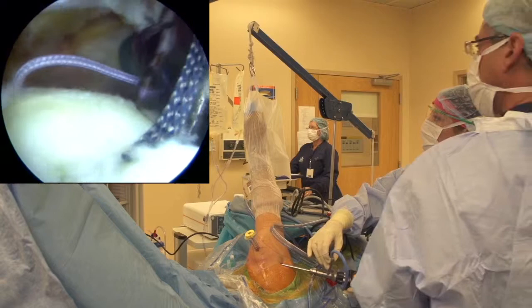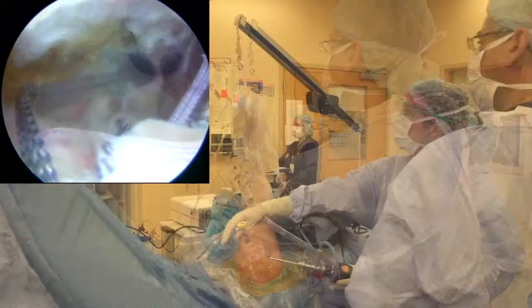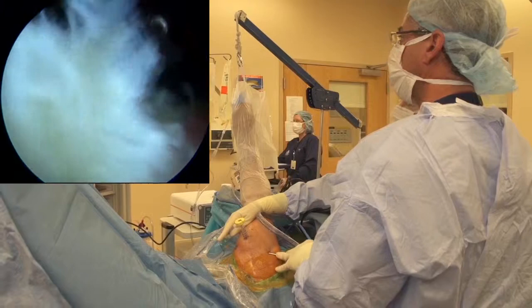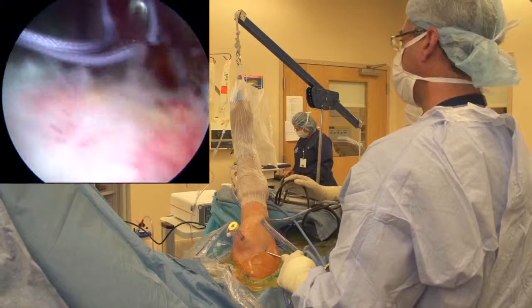We're not going to cut these because we're going to put this into our double row. Just reach in and grab our purples - got them. Now we'll get our blues out of the way. So we've tied our medial row at this point. We're satisfied that we've covered our footprint. There's a little bit of a pull-up dog ear here, so what we're going to try and do is tag that down a little bit with our anchor.